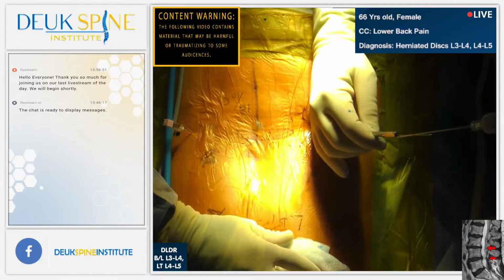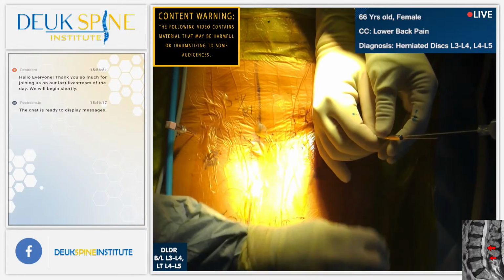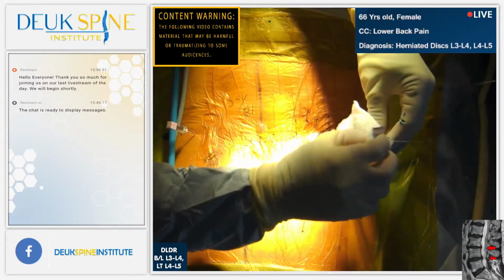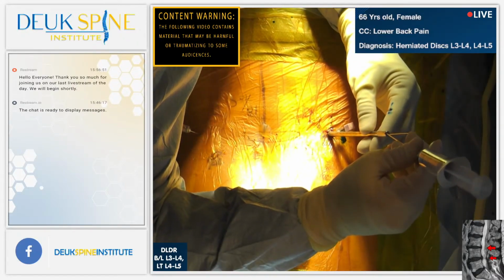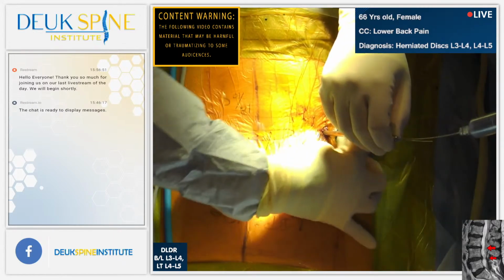I cannot see this. Can you see the hole? Can you turn the light a little bit? Can we turn off that light? Here. I see it. Works out well with his plane tickets. Yeah, they were going to do a week anyway. And we'll get him done Tuesday.